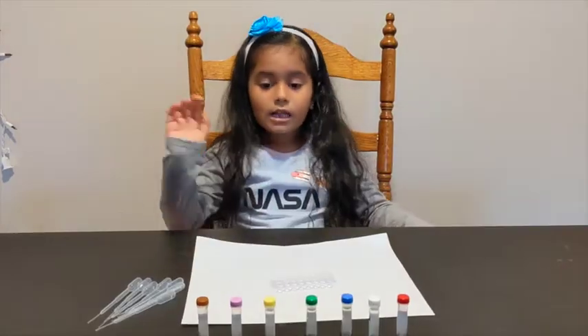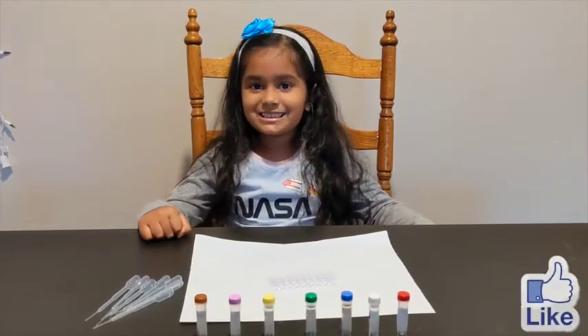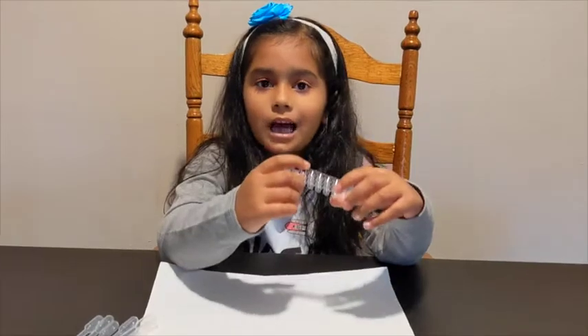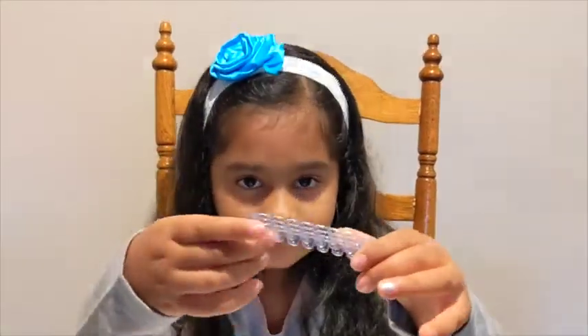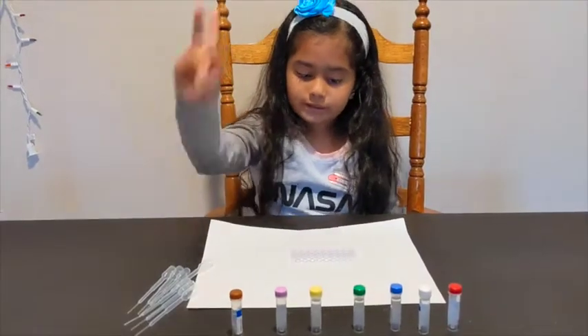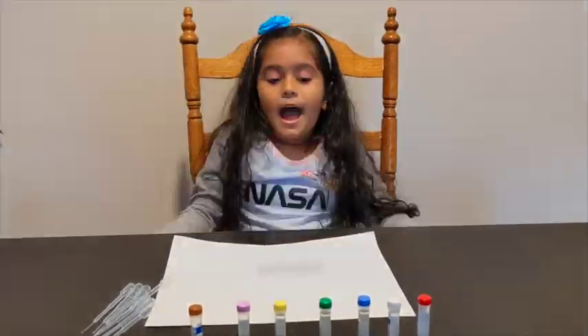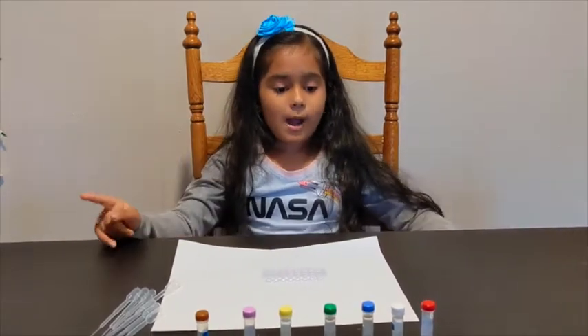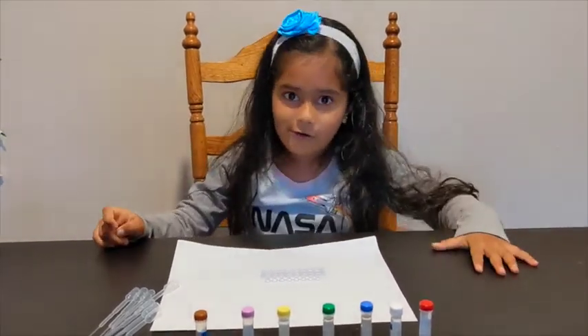This is all I need for the test. This is an ELISA plate. I have two samples. I predict that sample 1 has a coronavirus — a virus.